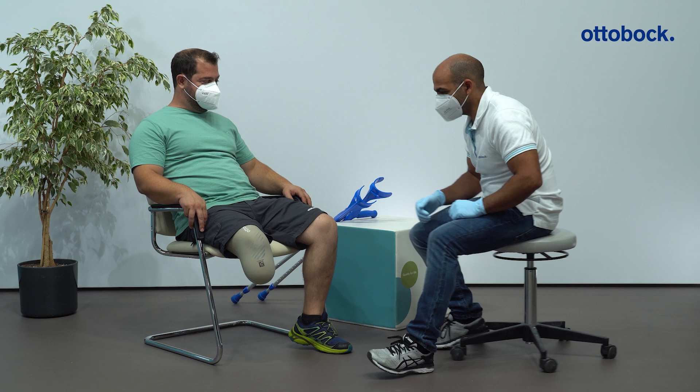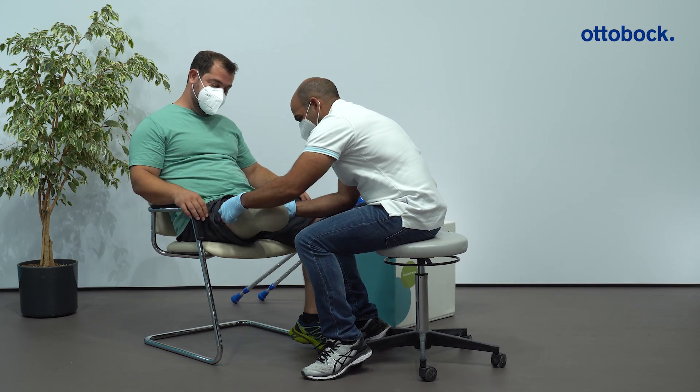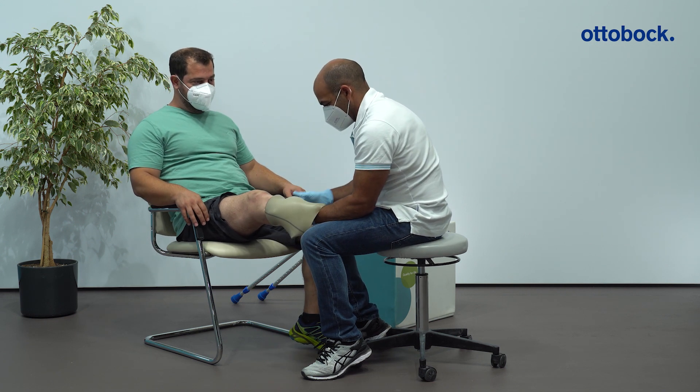Examine your patient and insert the needed patient data such as amputation side and level, body weight, as well as flexion contracture of the knee joint in the Empower setup app.